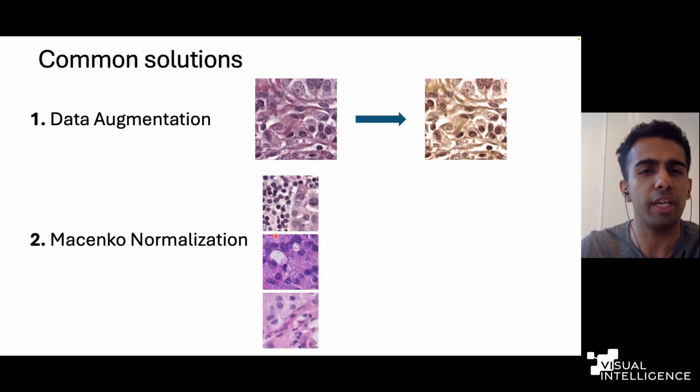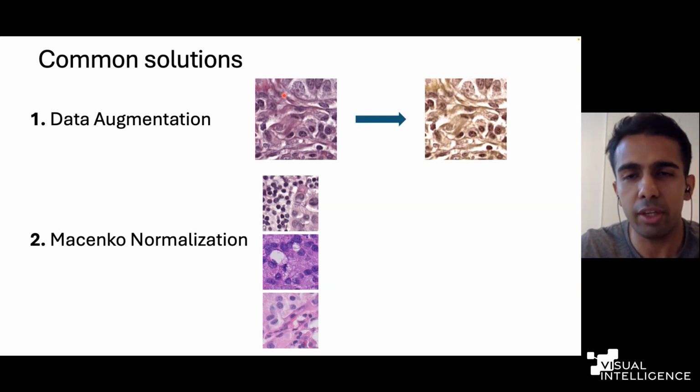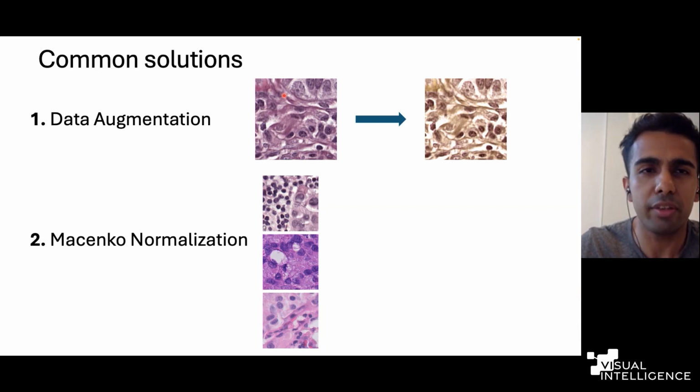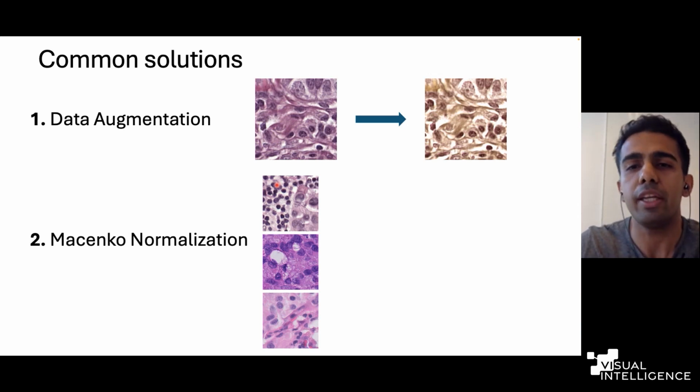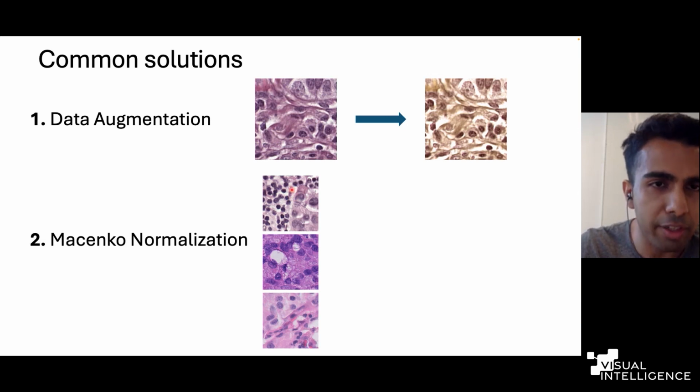So what they do is that you take, for example, 3 images from 3 different centers. You normalize the stains. The way staining works is that you have a tissue, and you stain it using two stains called hematoxylin and eosin. So hematoxylin stains the cell nuclei with a purplish blue color. The dark spots that you see are nuclei in the cells. And eosin stains the extracellular matrix and cytoplasm as pink. So outside of the nuclei should look pink.